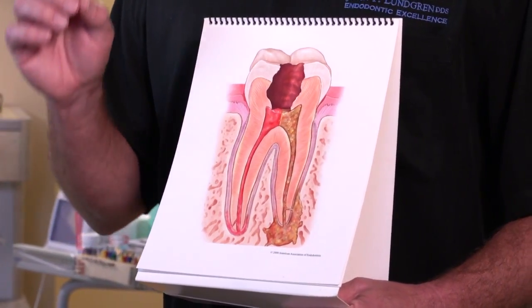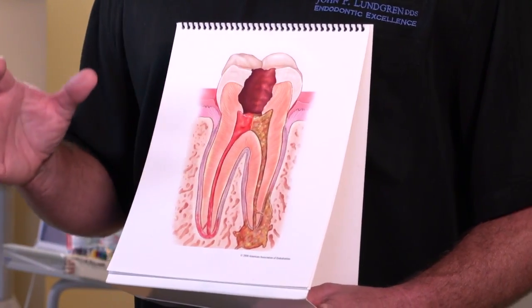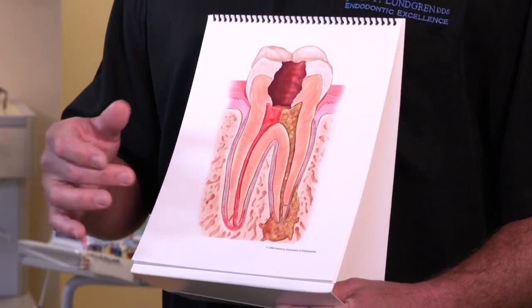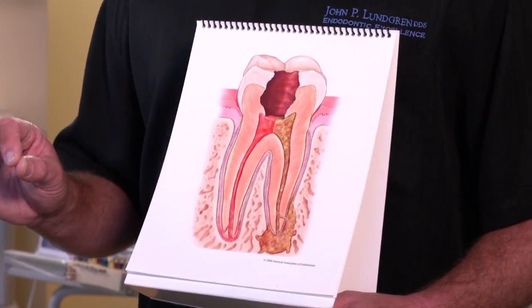So now what do we do? Well, we start by rubbing some topical gel around that area of the tooth to get the gums numb prior to anesthetizing it. Then we usually give 3 small injections around that tooth. We give you plenty of time to get numb. In a case where cold is a problem, we'll test the tooth to make sure you're not feeling anything.